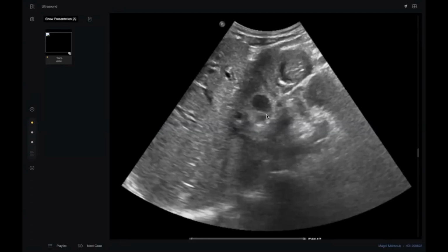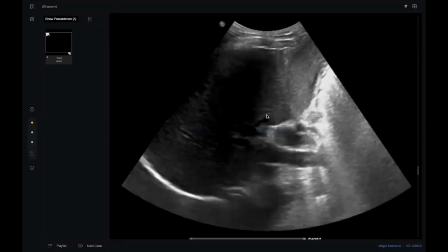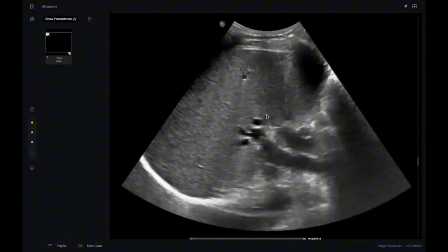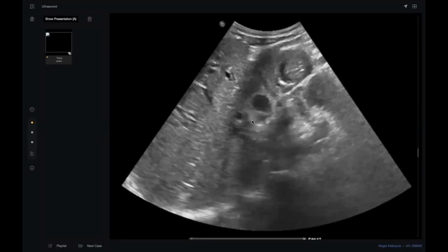And the stomach. Doctor, don't take a long time in ultrasound. You pick up the finding here, okay? And you exclude the very important thing, that there is no pancreatic pathology. So my advice to you is to jump to the next step. Ultrasound is a limited study.